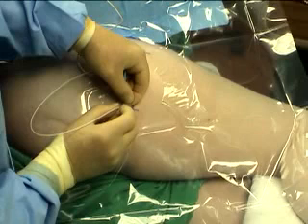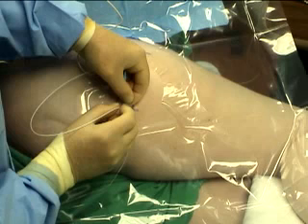If the twitches disappear, as in this illustration, the catheter is carefully withdrawn to inside the shaft of the needle again, such that the entire broad black mark is visible again. Make a small adjustment to the needle by rotating it 1/4 turn clockwise or counterclockwise, or by withdrawing or advancing the needle slightly and advance the catheter again. Repeat this maneuver as many times as necessary to ensure correct and accurate catheter placement and successful secondary block.